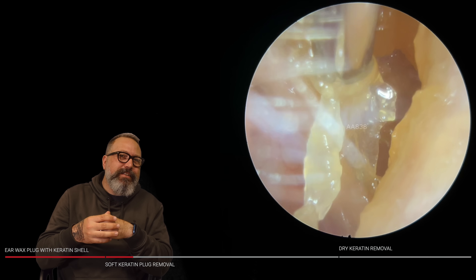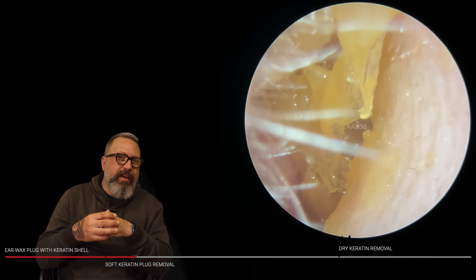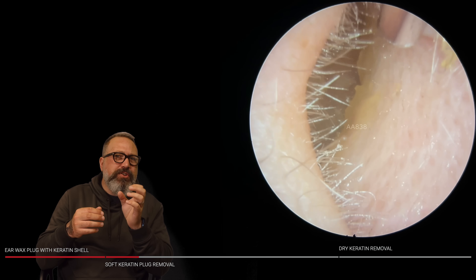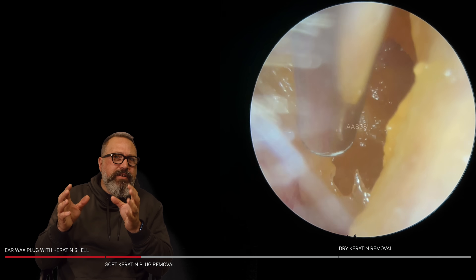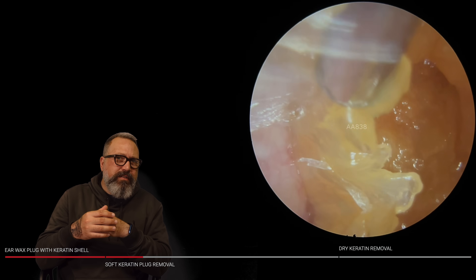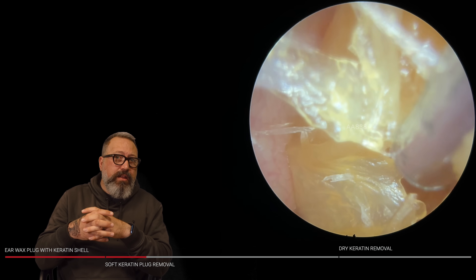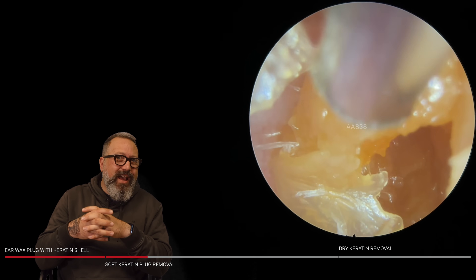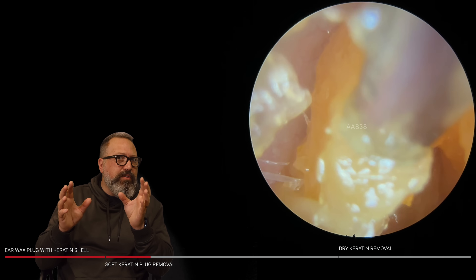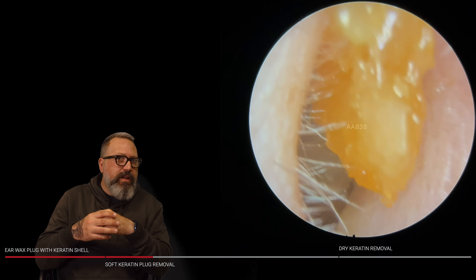We're just getting into this peel now of keratin. Look at that peeling away. We've got the fine end on here now, which is just helping to reduce any risk of clarinetting. This is going to be a difficult one unless this all just implodes into the suction tube. It's peeling quite nicely, actually — you can see it's not leaving a lot of residue on the canal wall, which means it's a really clean peel.